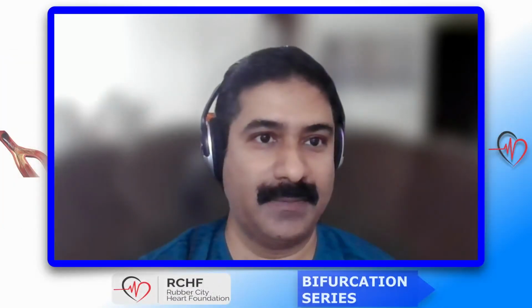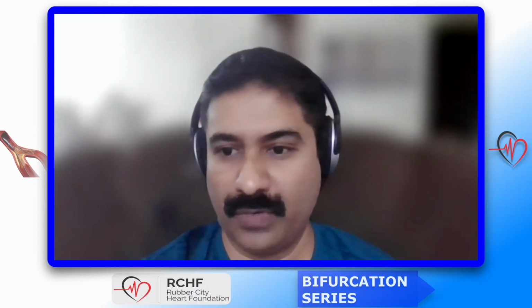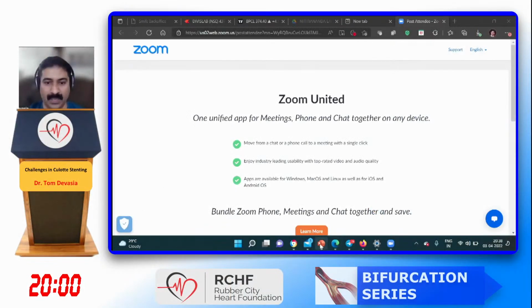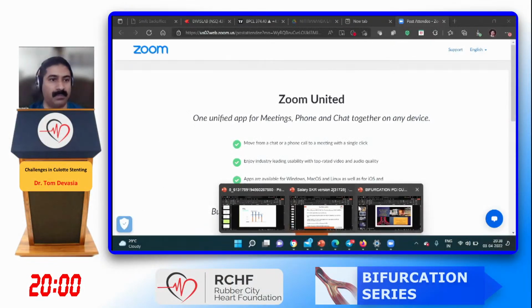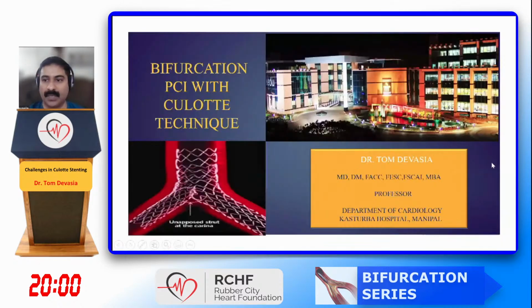Yeah. I think the first case is by Dr. Tom. Dr. Tom? Yes. Yeah. So the first case, yeah. Thank you very much, and warm regards to all of you from the temple town, University town of Manipal and Udupi. Please let me know if you can see my slides. Yeah, very much. Yes, Tom. Thank you. So I will be presenting 3 cases of Culotte bifurcation PCI. Please stop me when my time is up.